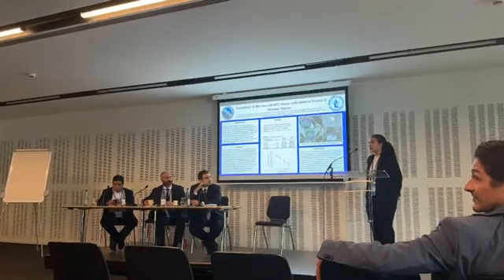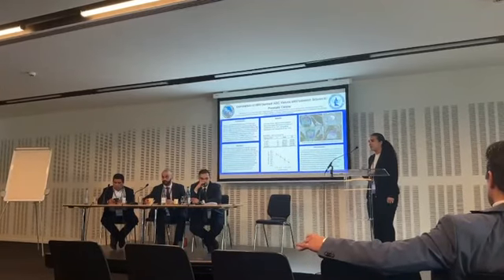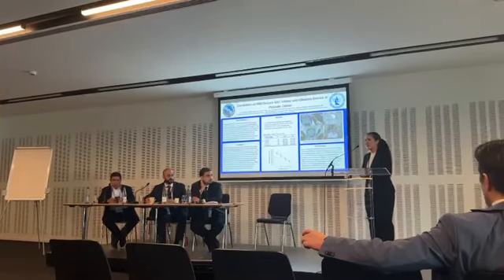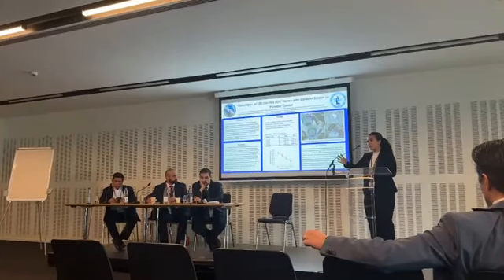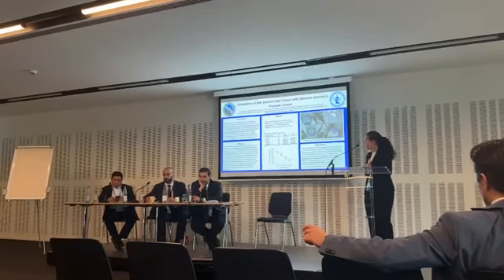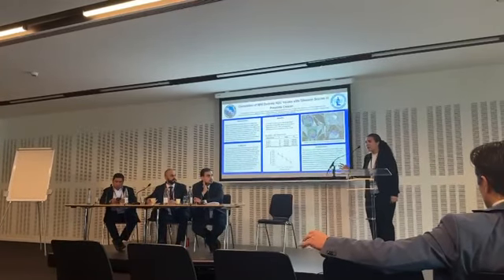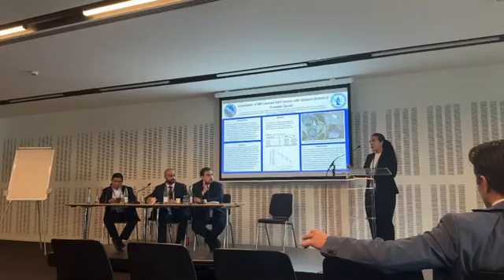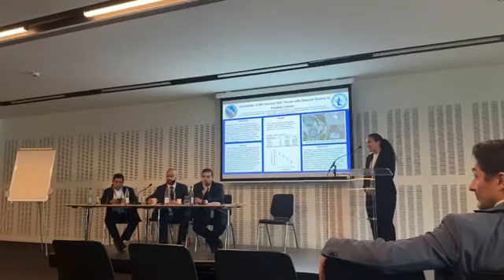So every MRI is different. We use two MRIs: a 3 Tesla General Electric and a 1.5 Siemens. I'm not 100% sure what B value, but I know that your MRI is going to give different ADC values from my MRI. If you look at other papers, our ADC values actually look kind of low, but that's normal for our MRI scanners, and your MRI scanner, if you wanted to repeat the study, would be a little bit different. Does that answer your question?